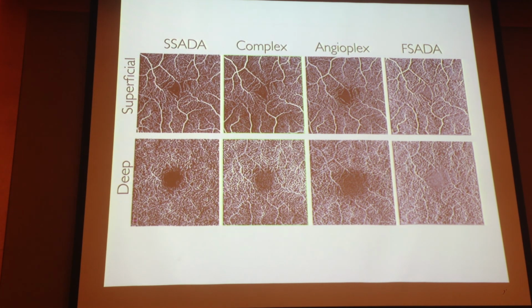But I think your hypothesis can be evaluated in 2 seconds. Just put some eye drops during the longer acquisition, and you will see if it's improving or not.